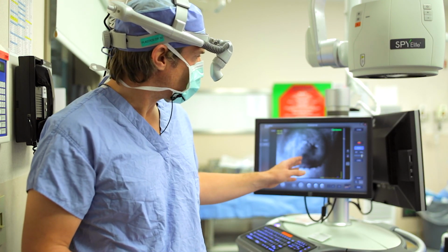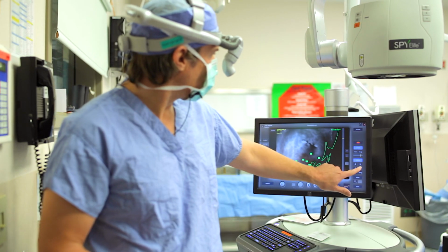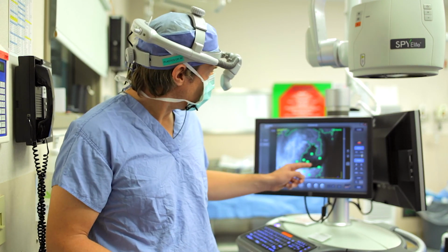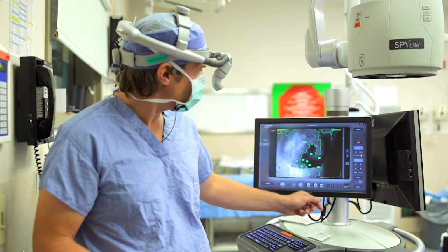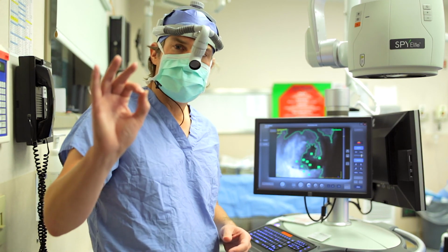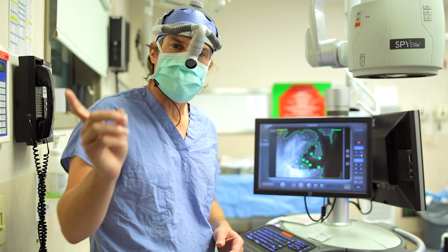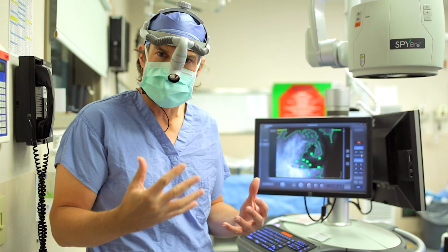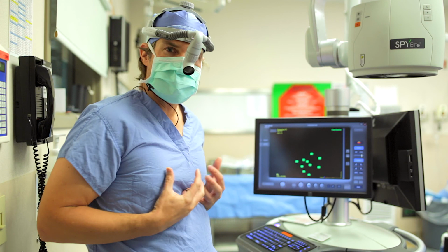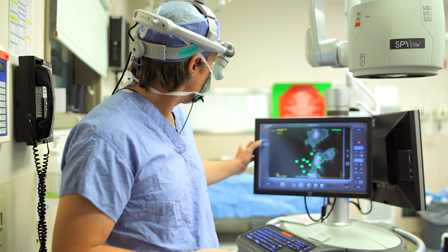I'm going to take all the stress off of the skin, because when I put my contour numbers up, I'm going to outline areas that are under that threshold level of 15, and in this area here, it's outlining those areas that are under those levels of 15, and it's saying, hey, Dr. Jacobson, pay attention to this. If you ignore me, I'm going to give you trouble, just like we saw in that video as we talked preoperatively. So no intervention, no translation of this information into my practice, it's going to give you a problem. But we're going to make an intervention.